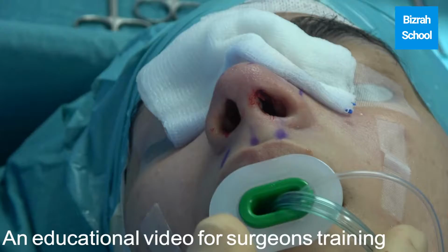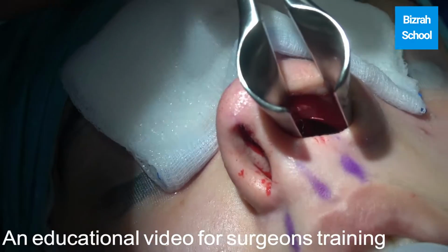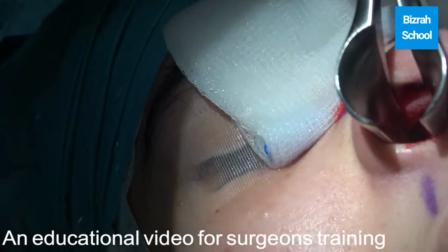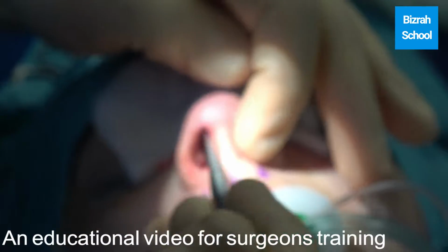So that's enough. Please look inside here, and you see the intact clean mucosal flaps. And then on the other side, look at the intact clean flaps. Very nice clean surgery. Less than 25 minutes. We have done full septorhinoplasty.